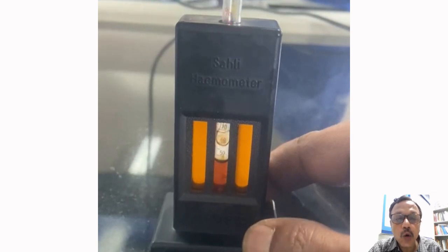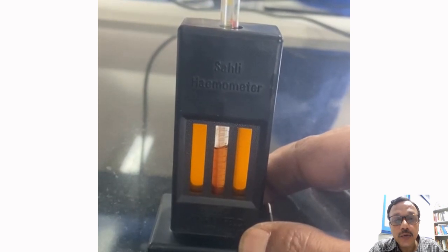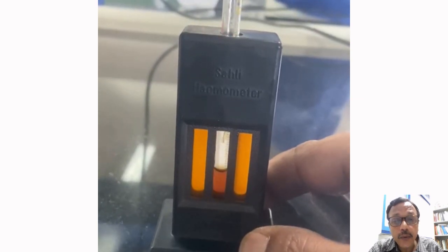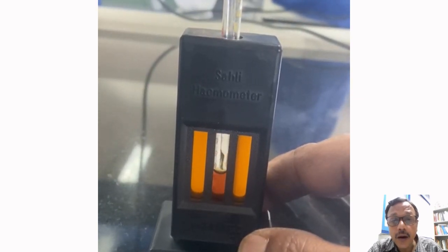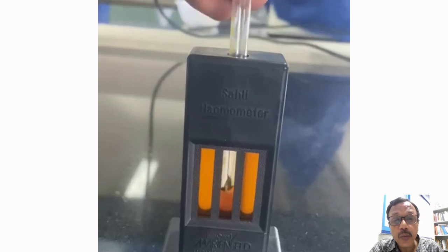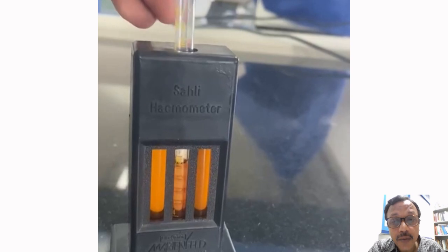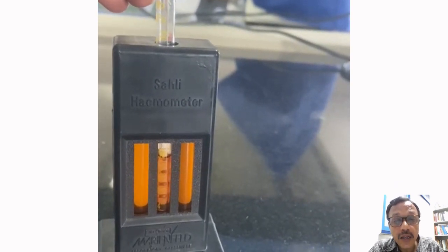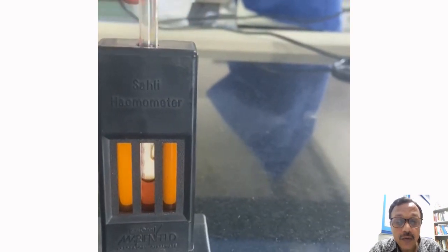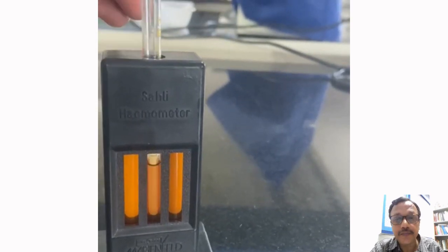Now, in the hemoglobinometer tube, you put N/10 HCl acid up to the lowest mark, to the level of 2. Then pour 0.02 ml or 20 cubic millimeter of blood from the pipette directly into the hemoglobinometer tube and wait for at least 5 to 10 minutes, so that all the hemoglobin is converted into acid hematin by the acid, which is a colorful compound, and we are going to match this with the standard color plate.